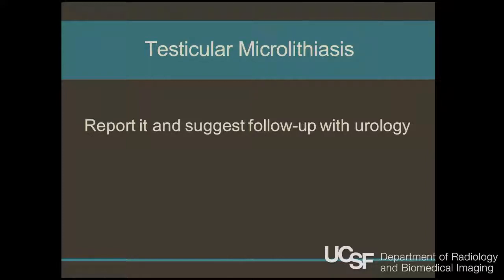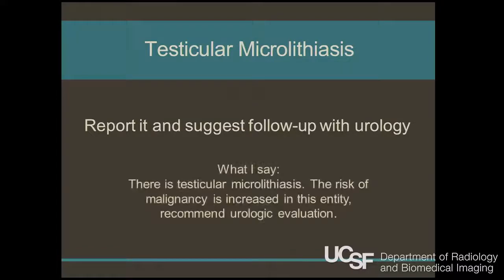If it's coming from a urologist, then I just report it to them because they know what they want to do with it. If it's coming from a primary care physician, I'll say something like, there's testicular microlithiasis, there is an increased risk of malignancy, refer to urology. And I think the urologists have a good sense of how to manage it.